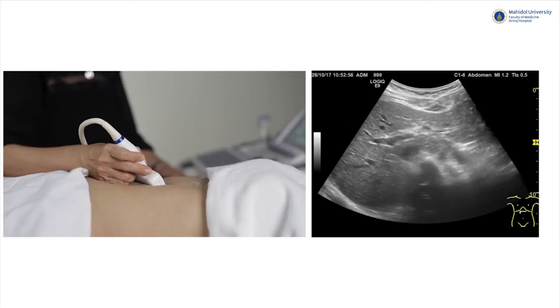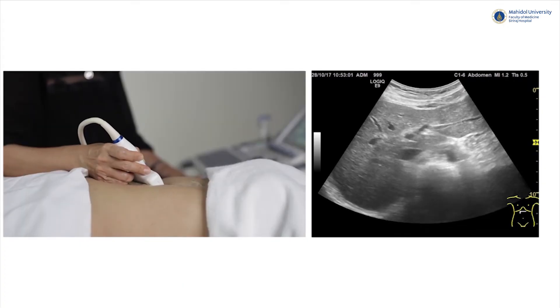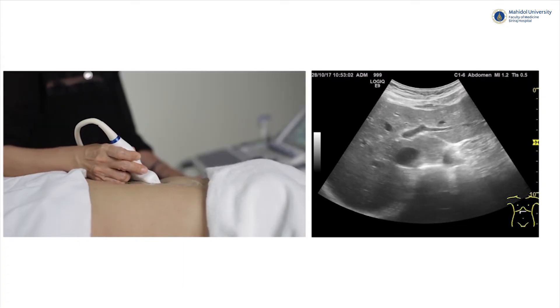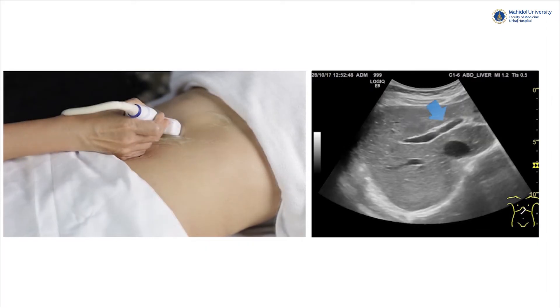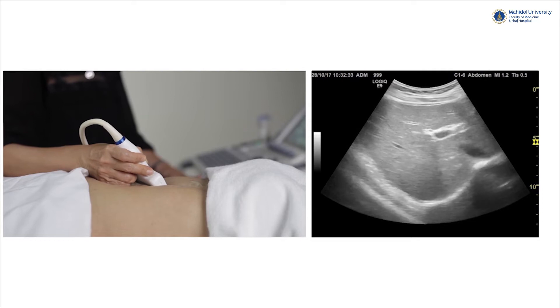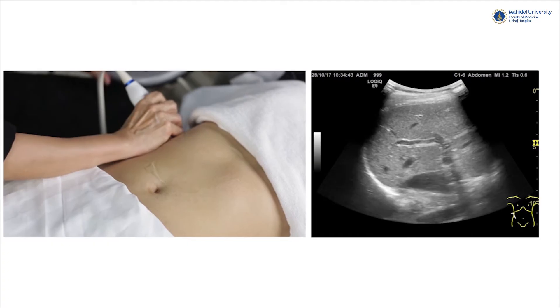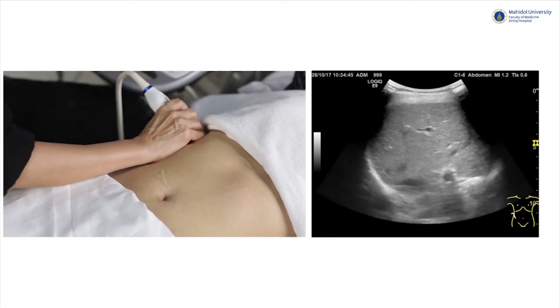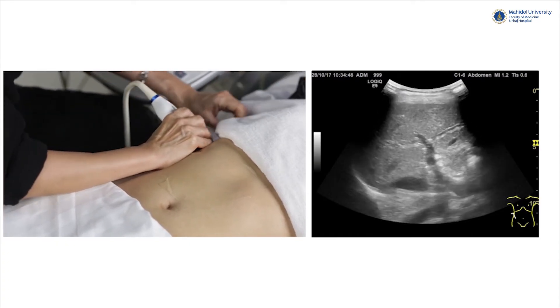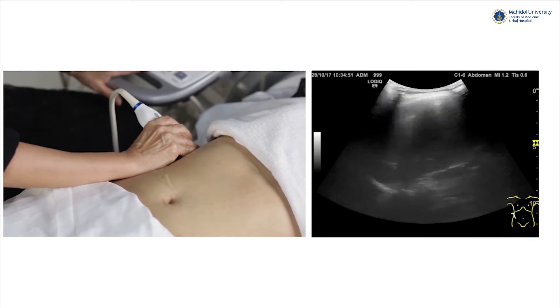Moving the probe along the subcostal area, you will see the left lobe continue to the right. To examine the right lobe, you can use both subcostal and intercostal scans, which means placing the probe in between the ribs. Asking the patient to perform a Valsalva maneuver may help push the liver downwards, which is especially useful in patients with a high liver position.